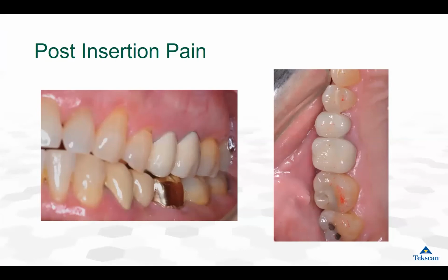The patient has had different dentistry done over the years, very similar to what you see in your practice. After the crowns were inserted, the patient immediately felt pain on number 16. And the dentist, over the course of a few weeks, kept trying to adjust the new crowns to fit better and provide comfort. And eventually what happened is the patient wound up parting ways with the dentist and went to see someone else for help.